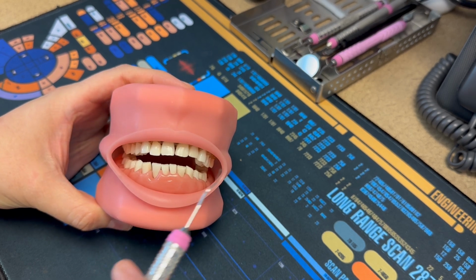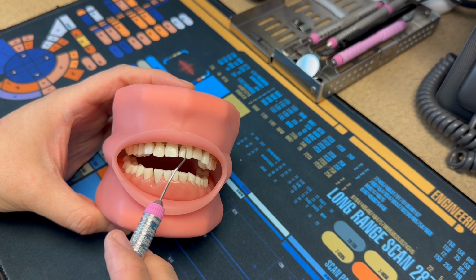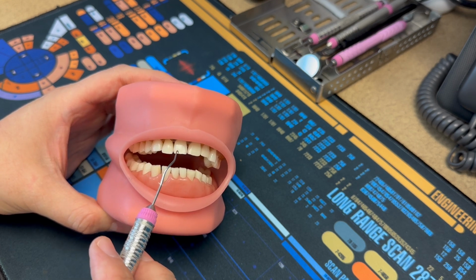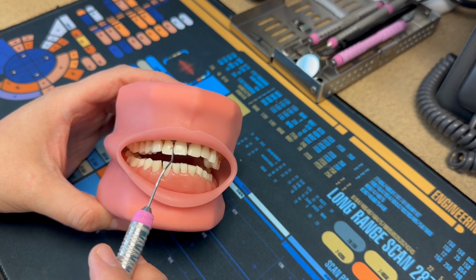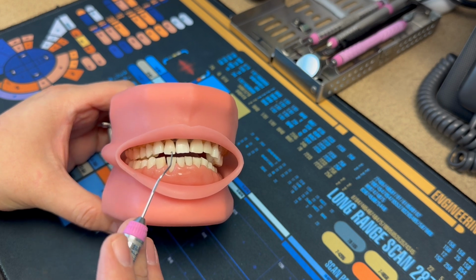because as you remember, when you're working on anterior surfaces towards, that means that these are surfaces that are towards you when in the correct seating position. So there's a lot of things that are kind of interrelated.